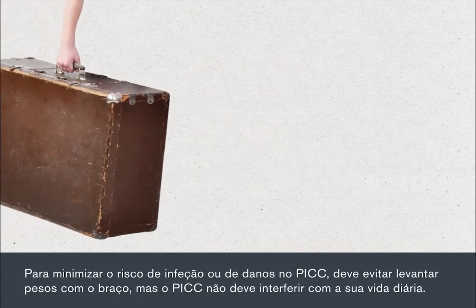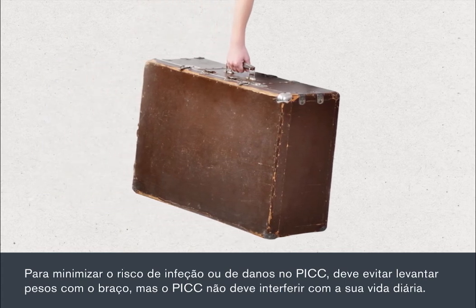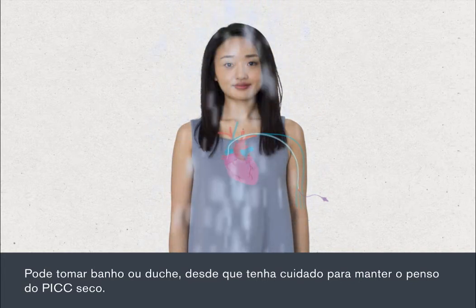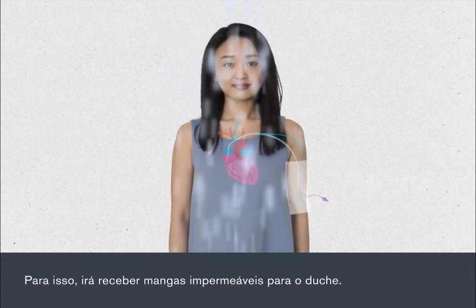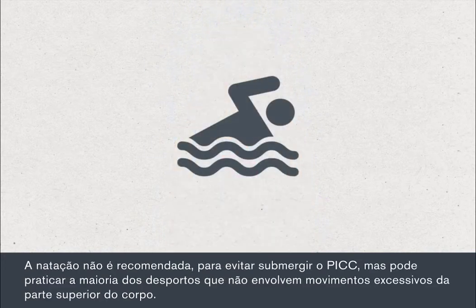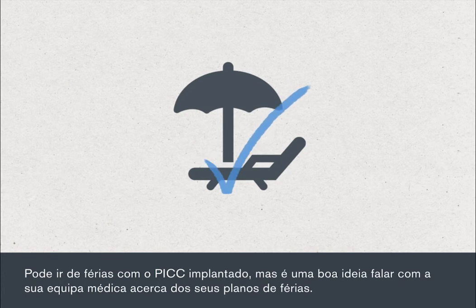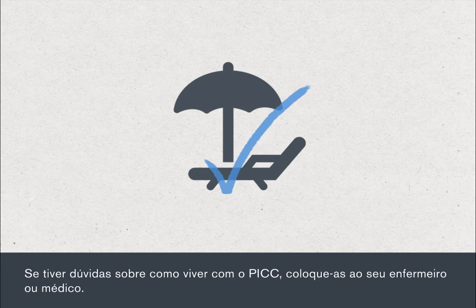To minimise the risk of infection or damage to your PIC, you must avoid heavy lifting with that arm. But having a PIC in place should not interfere with your everyday life. You can take a shower or a bath as long as you're careful to keep the PIC dressing dry. Waterproof shower sleeves will be provided for this purpose. Swimming is discouraged to avoid submerging the PIC in water, but you can play most sports that don't involve excessive upper body movement. You can go on holiday with a PIC in place, but it's a good idea to discuss holiday plans with your medical team. If you have any doubts about living with your PIC, just ask your nurse or doctor for advice.